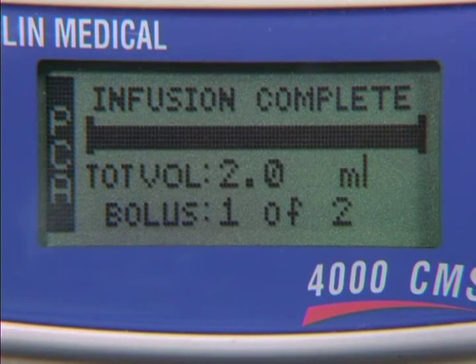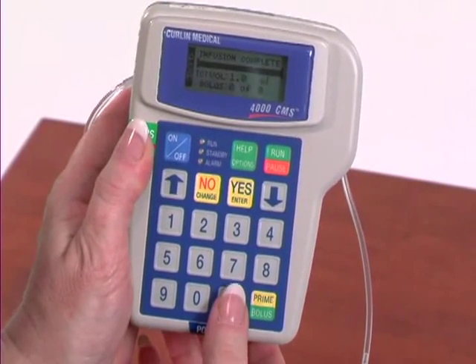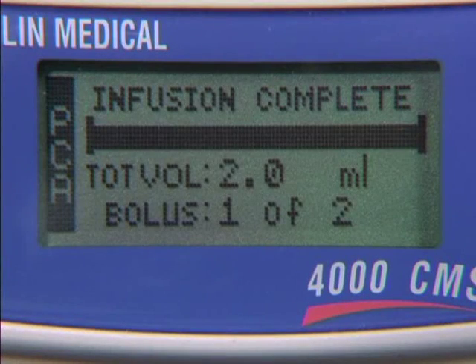Once the infusion is complete, the pump will alarm and Infusion Complete will flash on the screen. To silence this alarm, press the Silence button. If you would like to record your total information for the bag, do it at this time. When you repeat the program, it will clear all the current prescription infusion amounts on the screen. The shift totals and hourly totals will remain when reviewed using options.